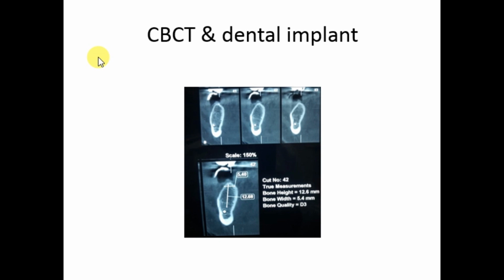CBCT and dental implant. How can I use it? I can use it in the identification of vital structures, calculation of distance measurements, determination of bone density. Now we will discuss some anatomical consideration in relation to dental implants.